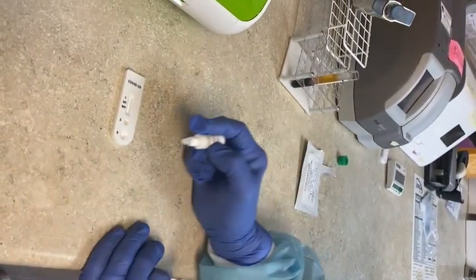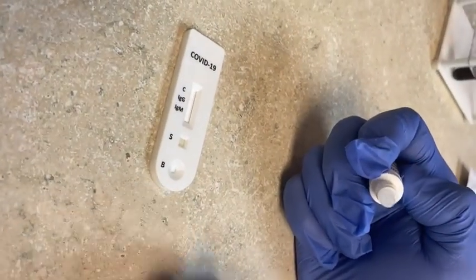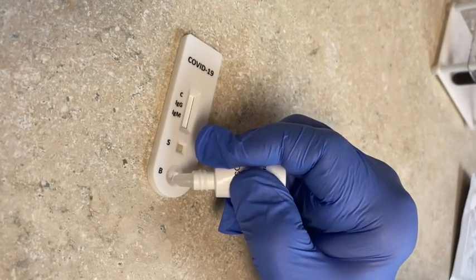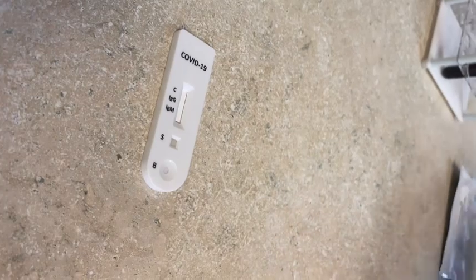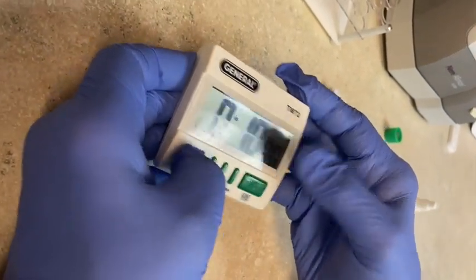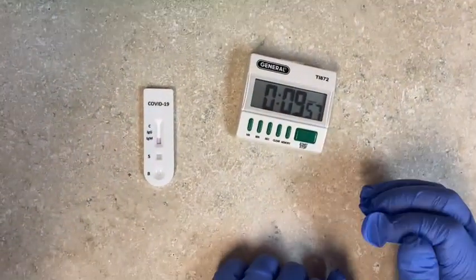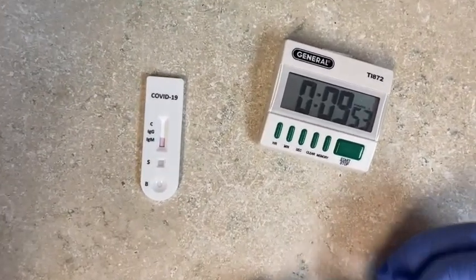Then use the buffer and put in two drops of buffer into the well labeled B for buffer — it's really easy. Then set your timer for 10 minutes. You have to give it at least 10 minutes and no longer than 20 minutes to interpret the reading.